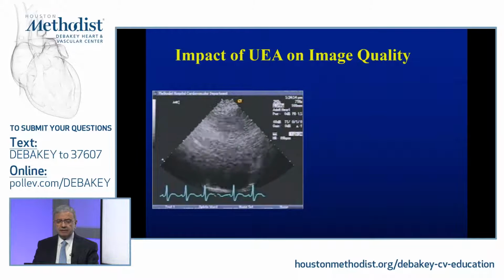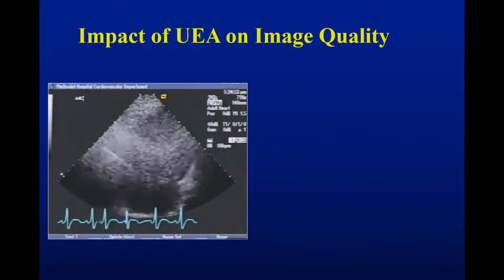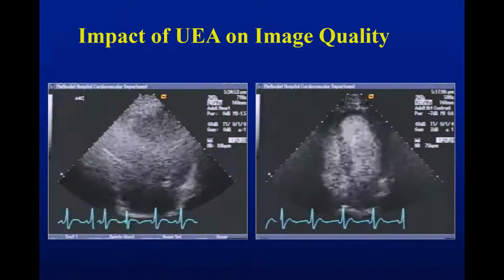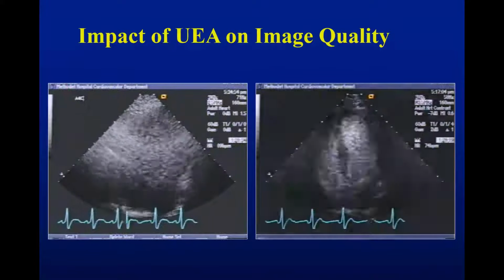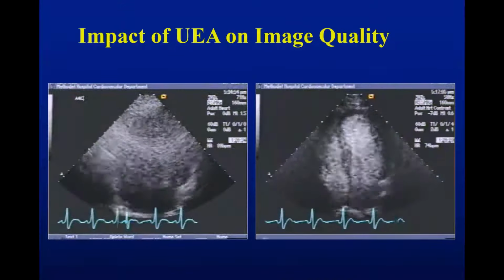Now, the interesting thing for all of us to remember is that when you use contrast as a diluted injection, the ultrasound settings also can interact with these microbubbles. And usually we don't show difficult pictures like you could see on the left side here, but you could see the power of using contrast to enhance visualization of the left ventricle or whatever chamber you're really interested in.